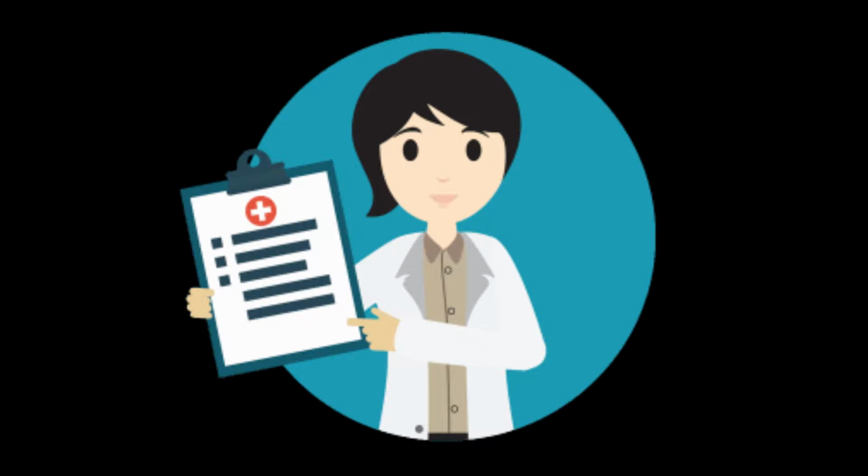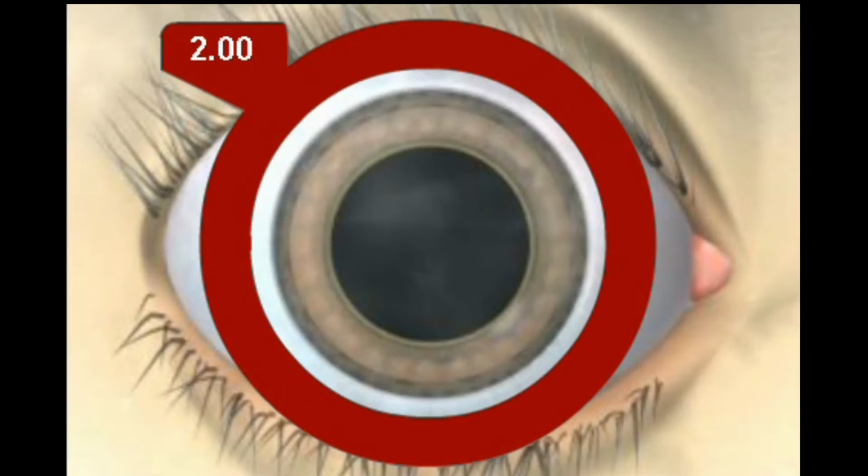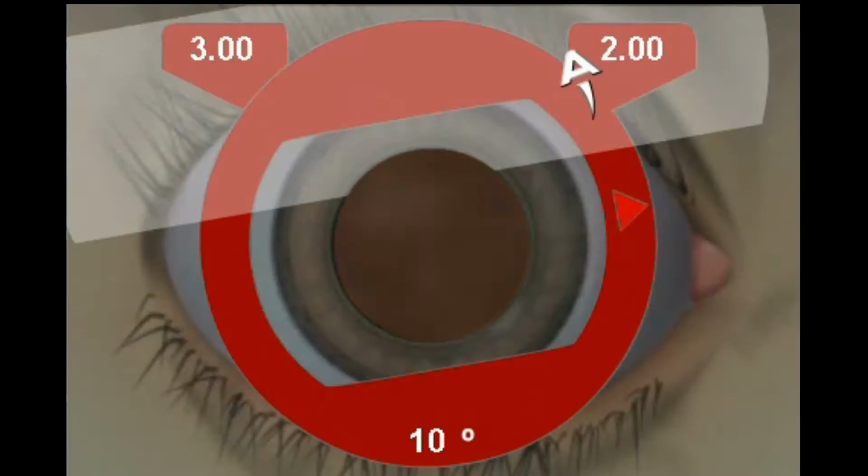What is retinoscopy? Retinoscopy is an objective technique for investigation, diagnosis, and evaluation of the refractive status of the eye. It utilizes the natural optics of the eye to determine the refractive error and does not require the patient's responses, hence eliminating problems of language difficulty and bias.